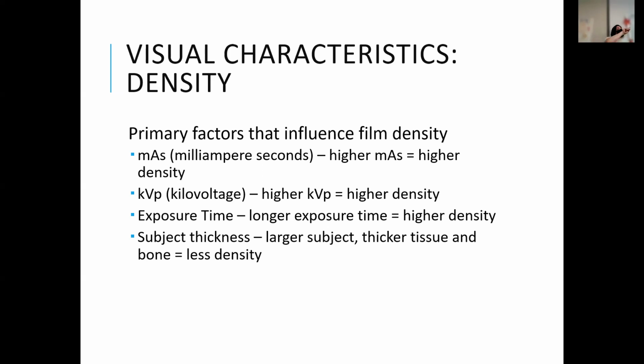Exposure time: when you push the button outside the room and select from anterior, premolars, bitewings, maxillary molars, mandibular molars, what you're changing is exposure time.